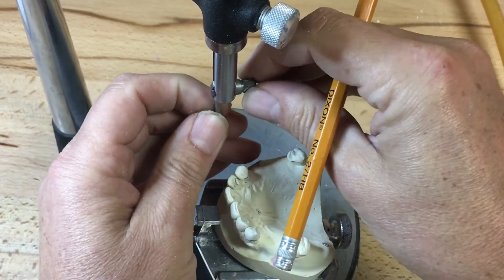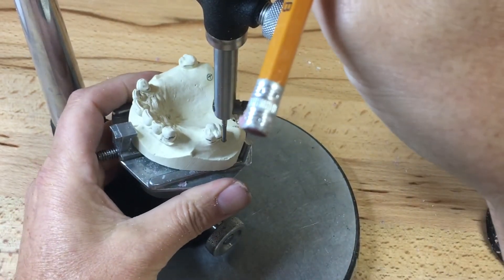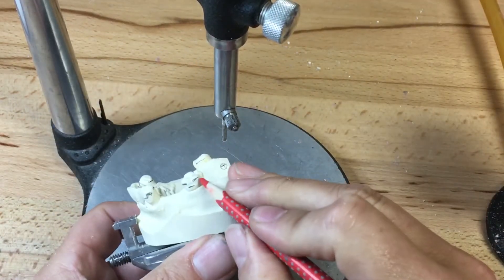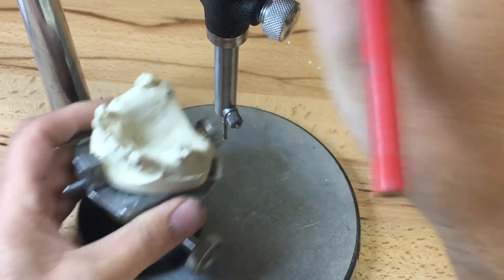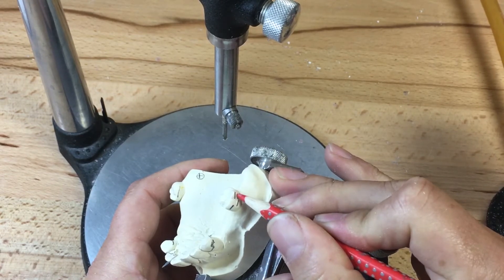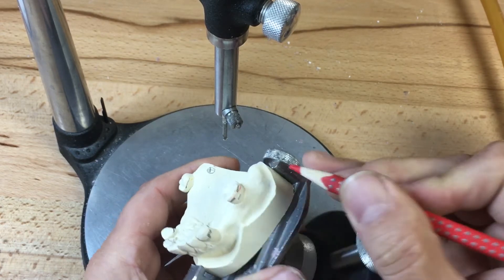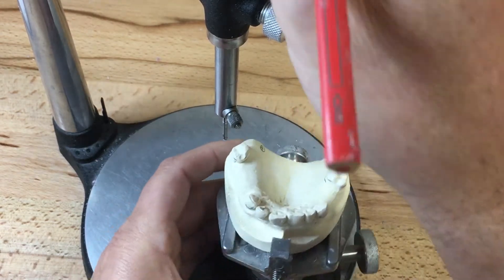Once I'm finished marking the height of contours, I'm going to put in the 0.25 millimeter undercut gauge into the surveyor. I'll measure the depth of undercut on the distal buccal of 1-7, take my red pencil, try not to scratch the tooth, double check that this is the point of engagement, and then freehand one third below the height of contour — two thirds above would be my retentive arm, drawn in red. Then I'll do the other side.